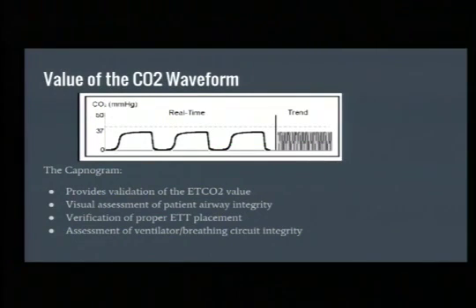So your capnogram provides validation of your end tidal, a visual assessment of a patient airway, verification of your ET tube, and we'll show here in a bit what it looks like when it's in an esophagus, and an assessment of your circuit integrity of your ventilator and your breathing circuit.